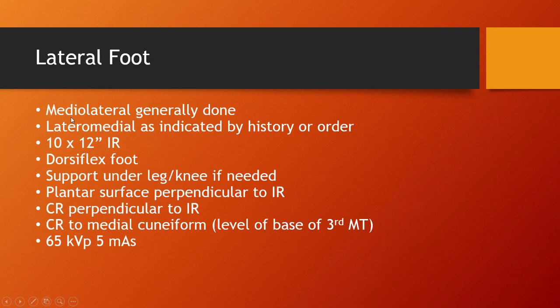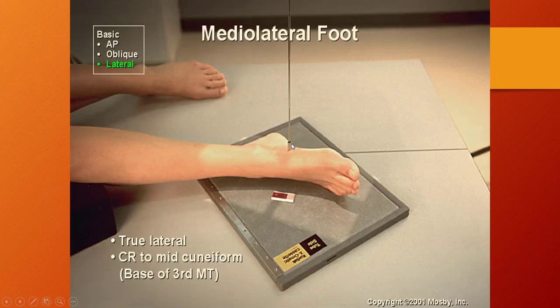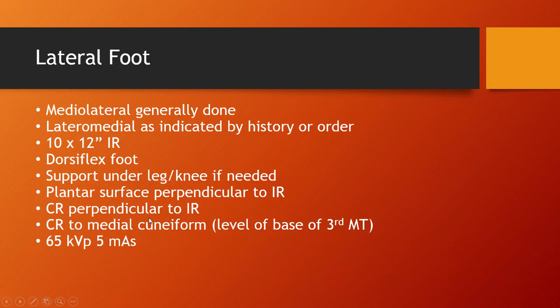Your lateral foot is going to be done with a medial to lateral projection. So right here, medial to lateral, come through the medial side. That projection exits out of the lateral side. Again, you're going to place it on a DR plate or a 10 by 12 image receptor. Dorsiflex your foot, so you're going to pull that foot up.